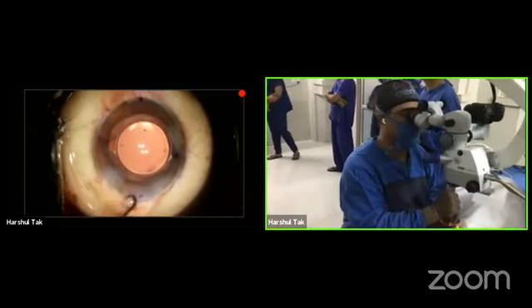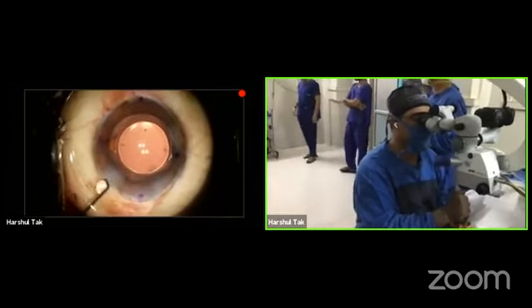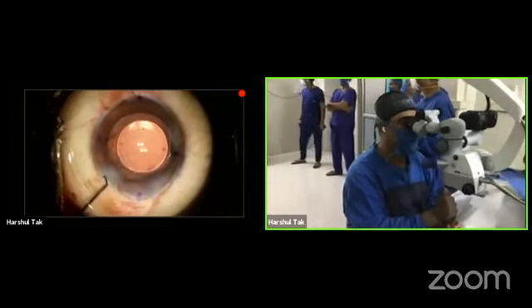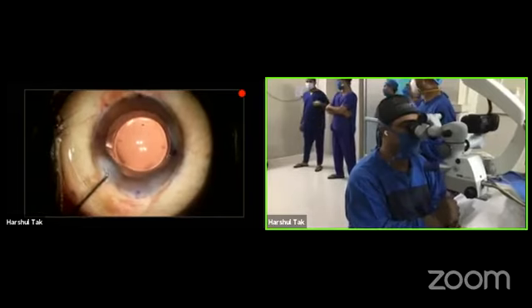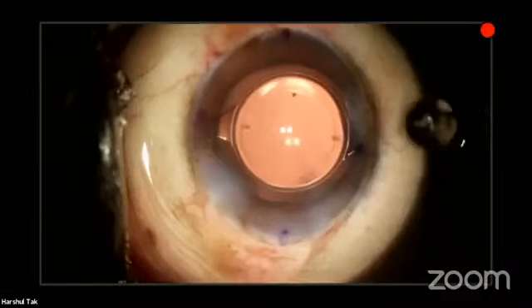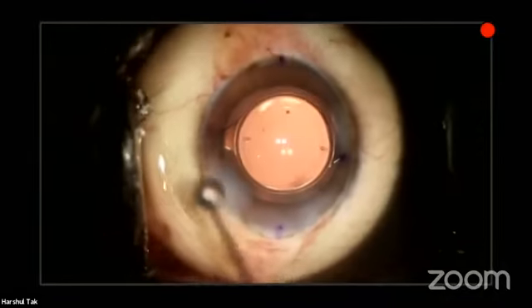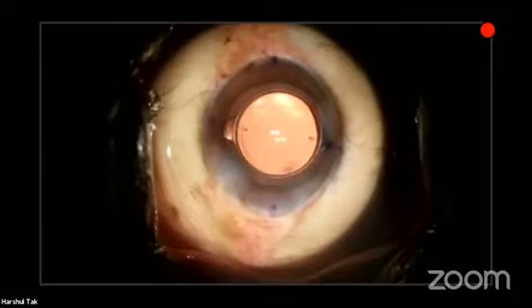I don't use viscoelastic. And this is my special modified hydro stitch cannula, which is bent at 85 degrees. It has a 1 millimeter tip so that I can easily hydrate all the incisions in topical anesthesia. You can see the IOL is nicely sitting there.